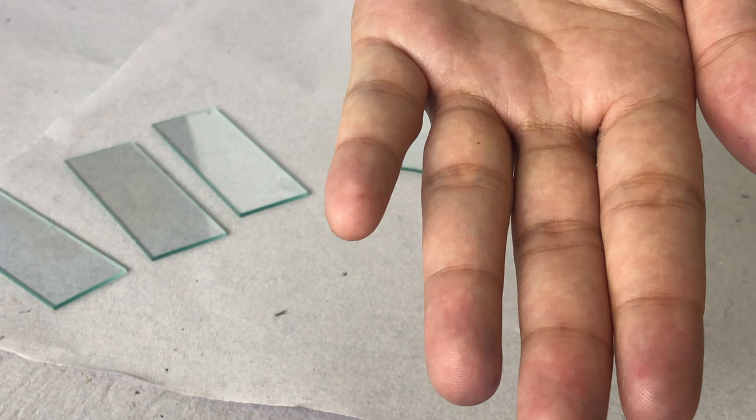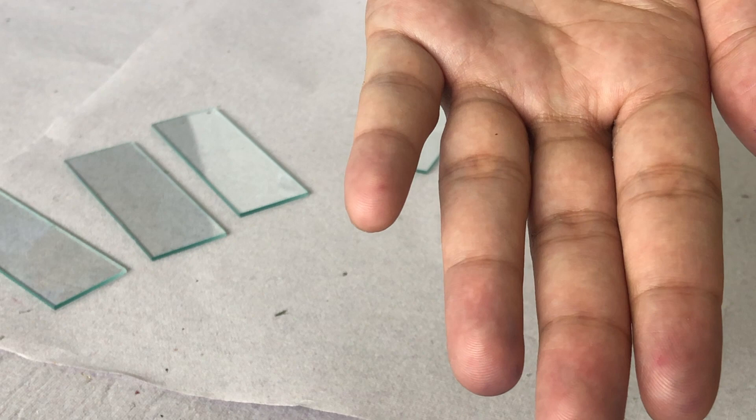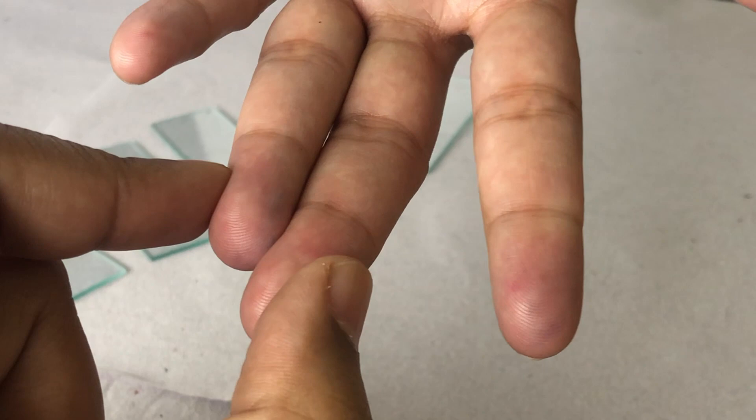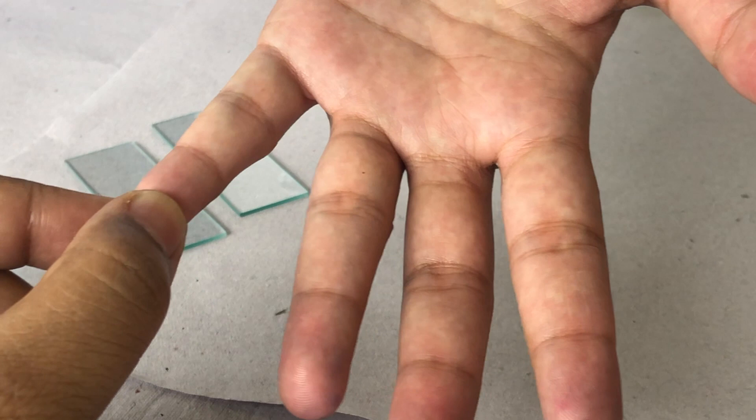For making the smear, we need blood. We can get blood by pricking the finger. For pricking the finger, we need to ensure that we use only these two fingers. We cannot use a thumb and we cannot use the little finger.